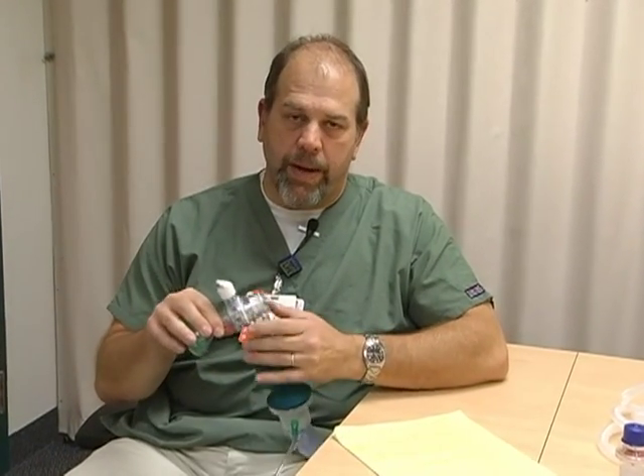The first one I'm going to talk to you about is this new resuscitator bag that we're going to be using. You're probably asking yourself why you have to be shown a resuscitator bag — you've used these things for years. But it's a new thing, and there are a couple of important things I want to point out that we need to know.